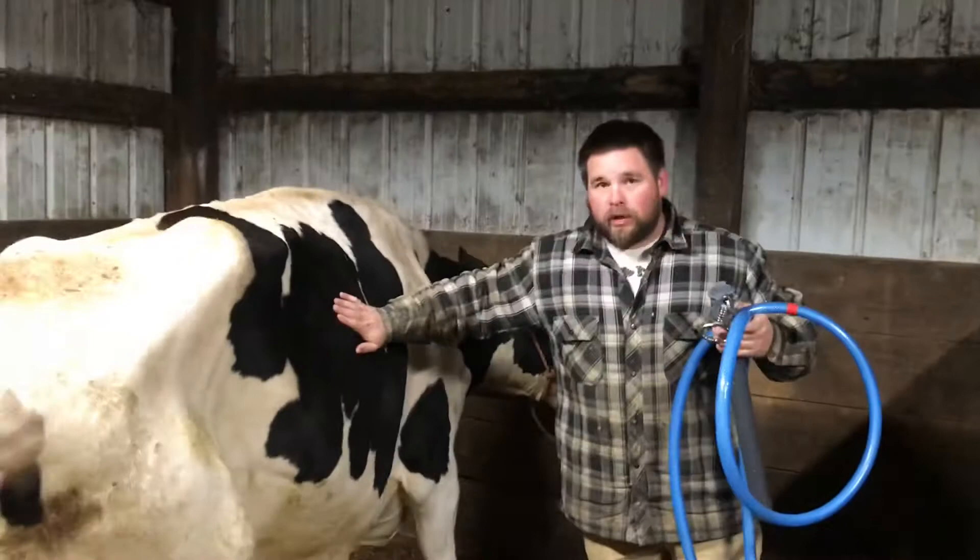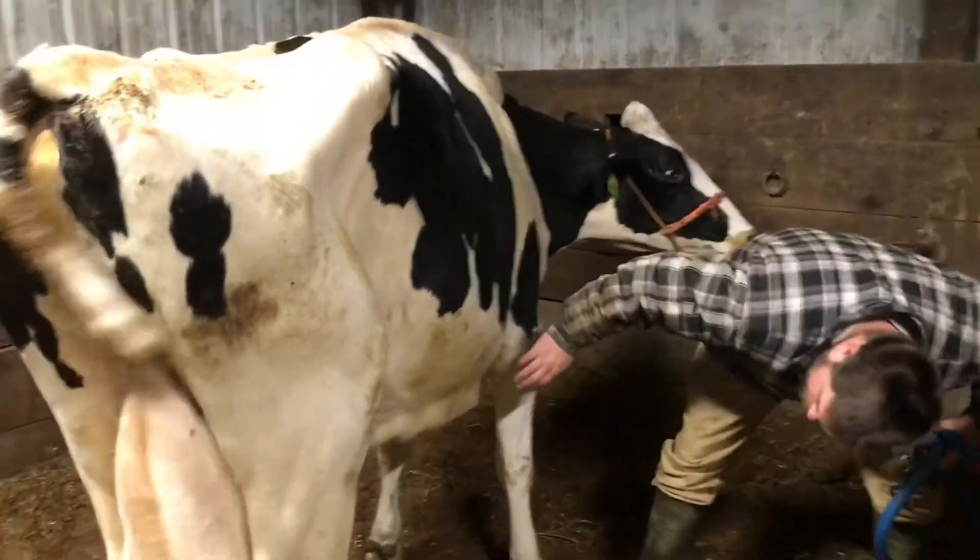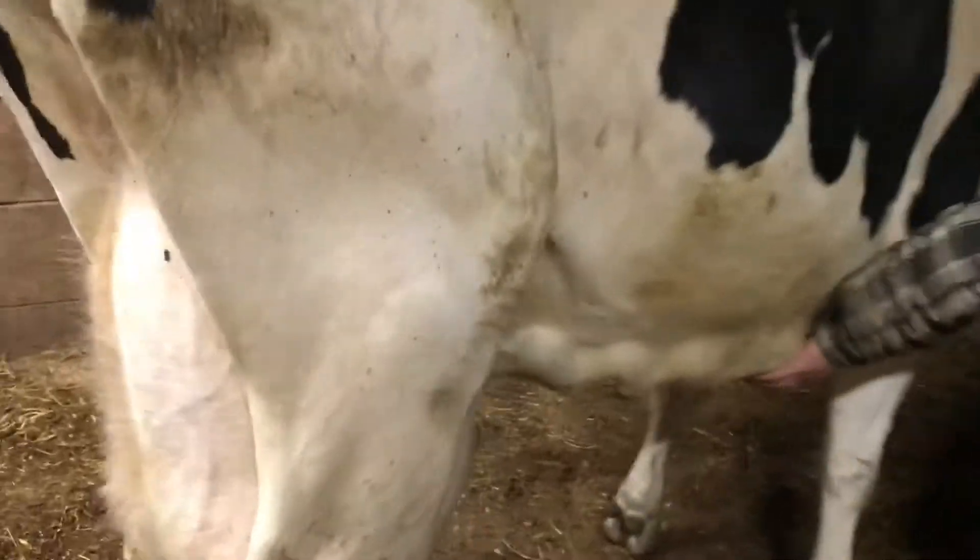This is the cow we did the roll on today. She had a twisted stomach. You can see right here — that's what we did today. We toggled her: we took the air out of her stomach and then stitched her stomach to the lining of her belly. That'll keep the stomach from twisting again.